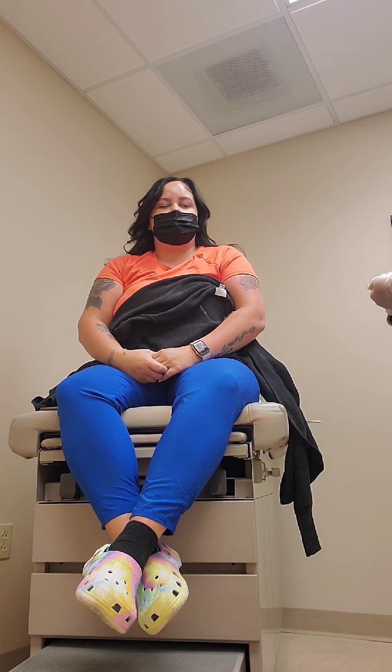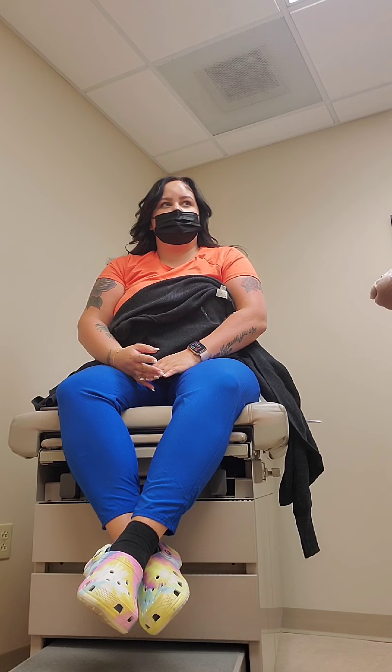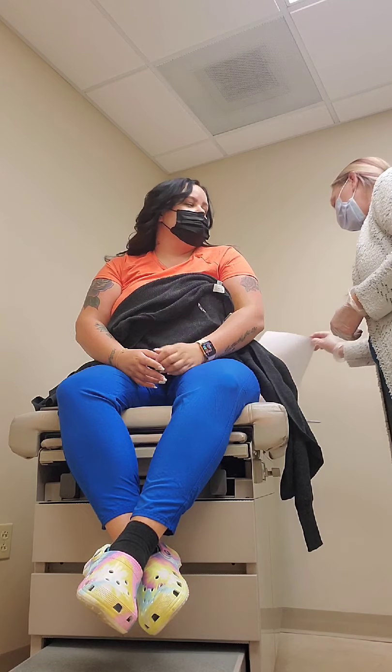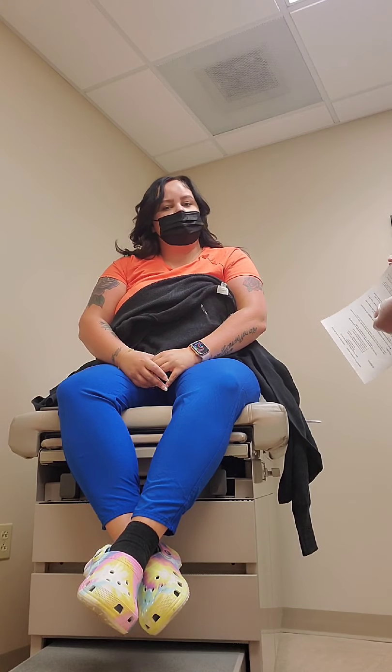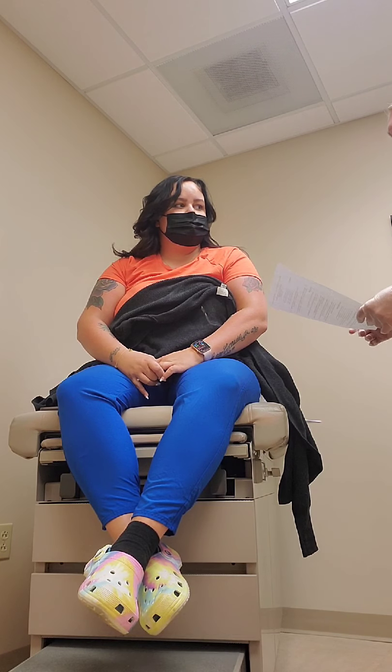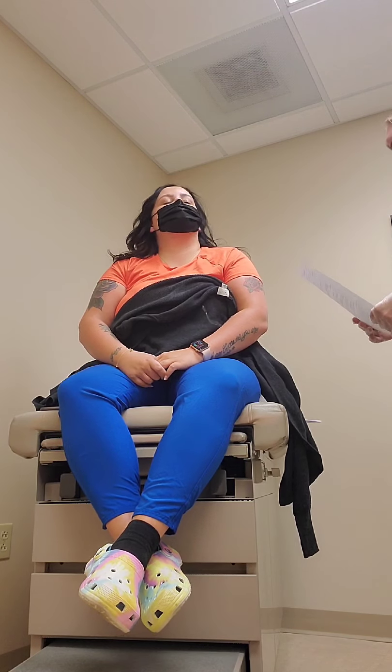And then the next thing we're going to check is going to be the eyes. Test visual acuity, bilateral and separate with a pocket visual screening. I'm going to have a chart here that I'm going to hold 14 inches from the patient's face. The patient does not wear any glasses.